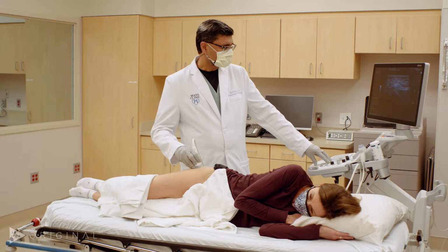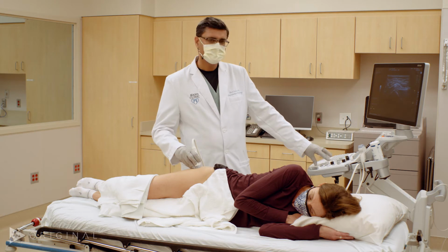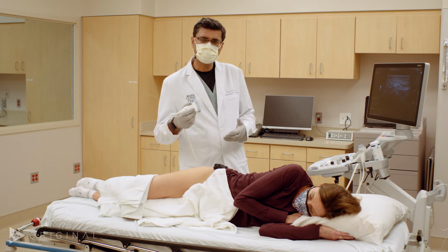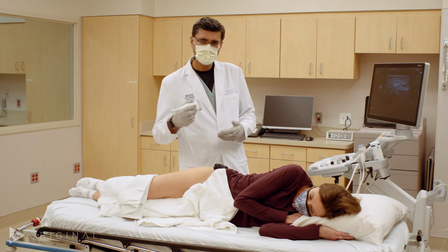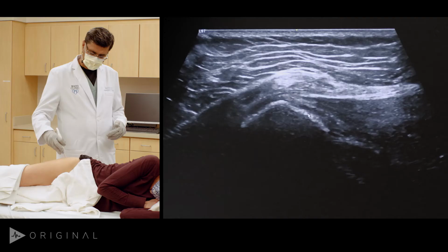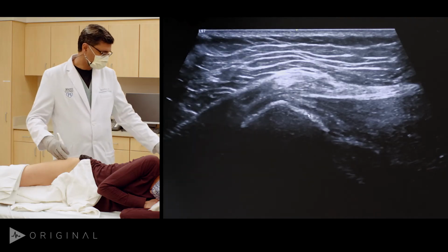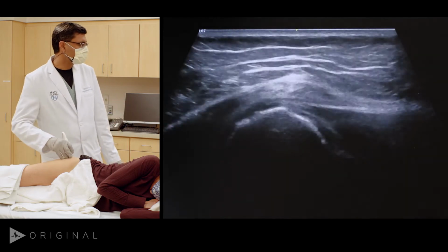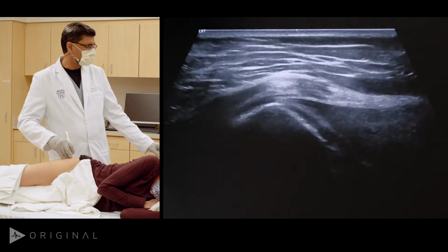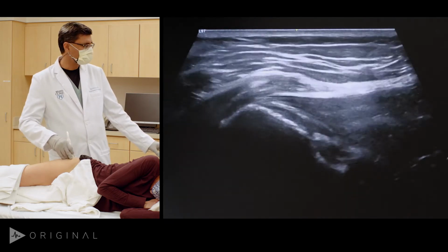Now, because of this unique orientation of the trochanter, the transducer doesn't follow any anatomic plane, but tries to get the best cross-sectional and long views it can based on the expected trajectory of the tendon and the muscle. So in this position, we know that we found the trochanteric ridge, and in that position, now I angle anteriorly.